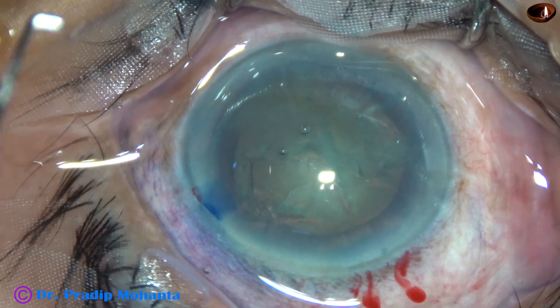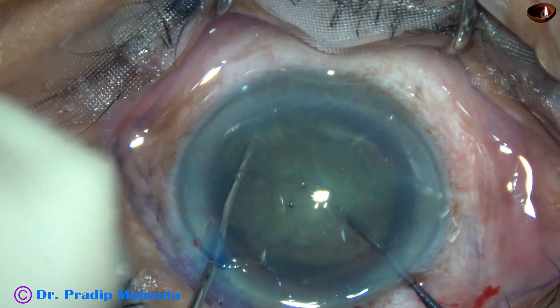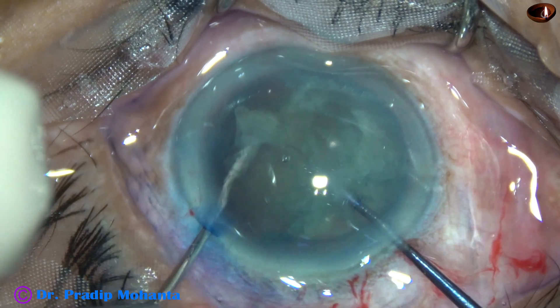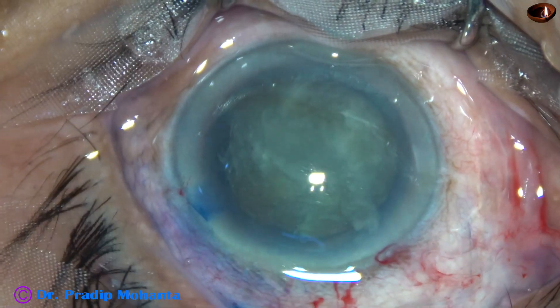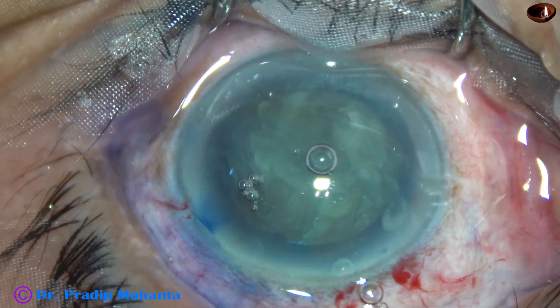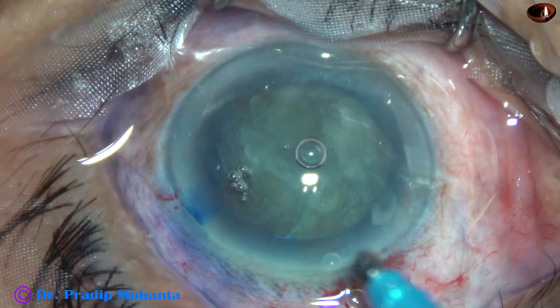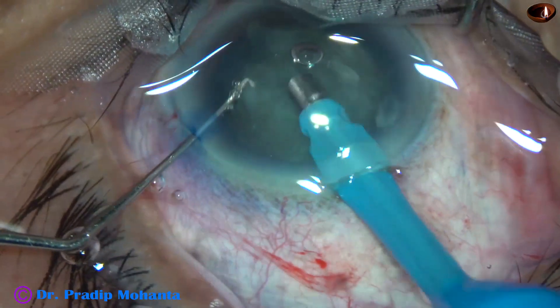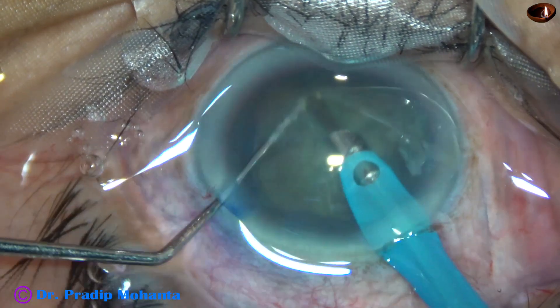Rexis and hydro-dissection have been done, and here goes the pre-chopper. The instrument in the left hand is a blunt long chopper — a ball-tipped long chopper. In this case, I have divided the nucleus into two halves and attempted division of one hemi-nucleus into two pieces. But the division of the hemi-nucleus has not been complete. But it doesn't matter — once we have divided the nucleus into two halves, the rest of the surgery is very easy.